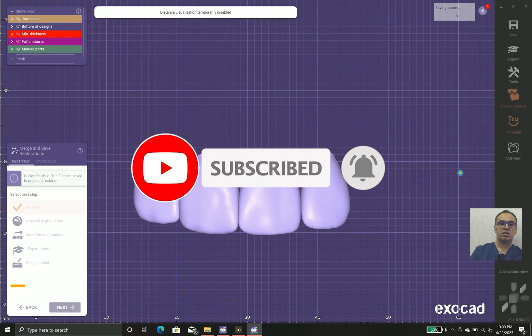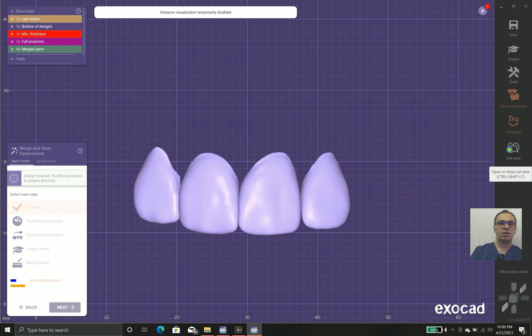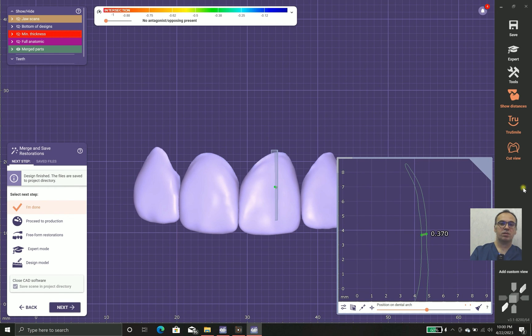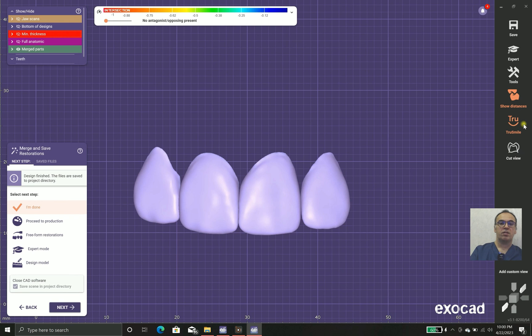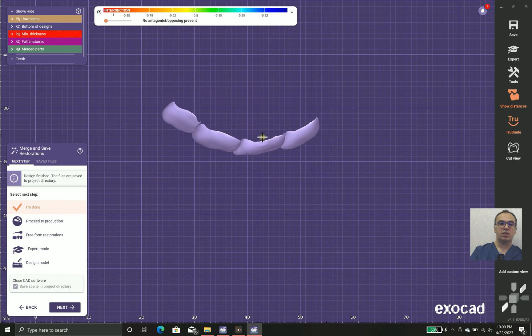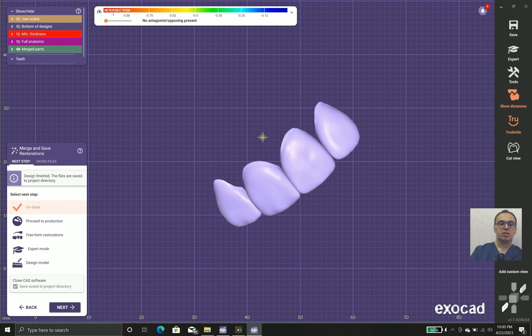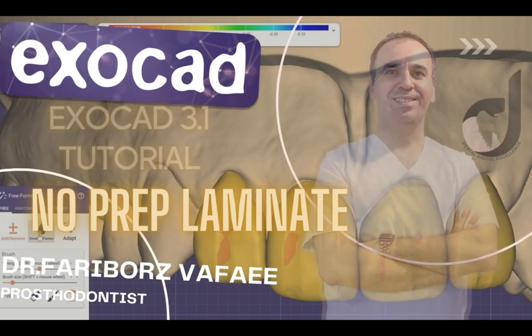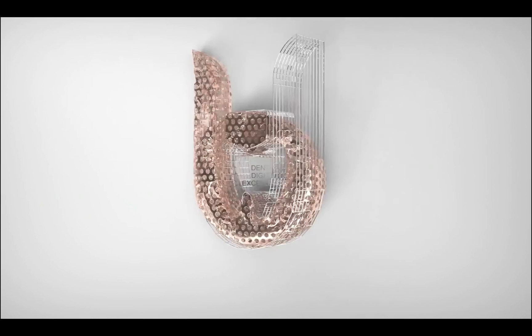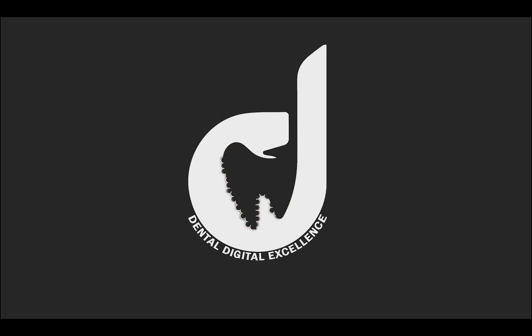Okay everybody, everything is done. We have beautiful laminates. Of course the job isn't finished yet — there are other steps. Milling or injection for these laminates is breathtaking because they are so thin.